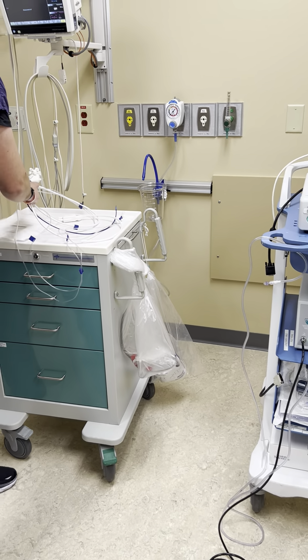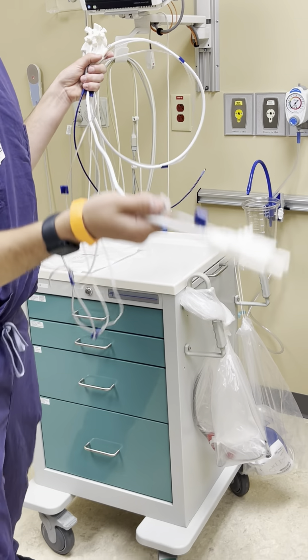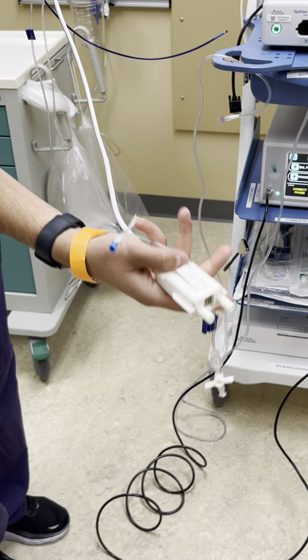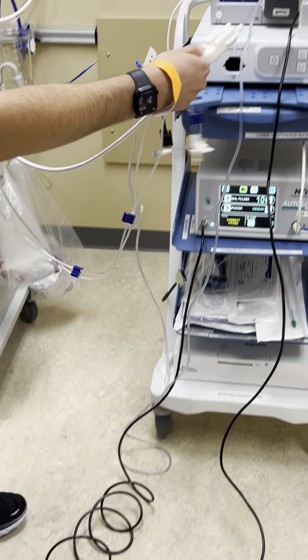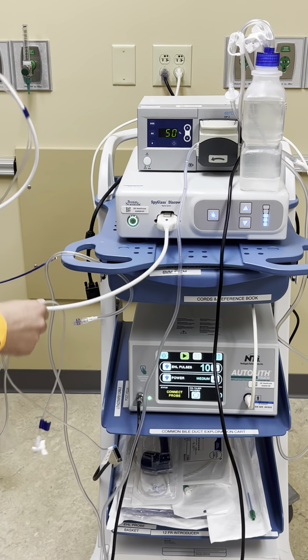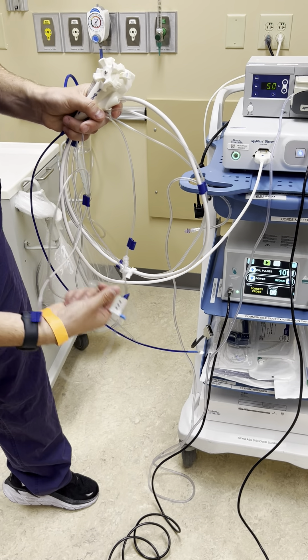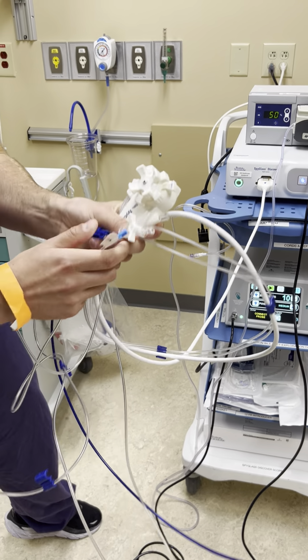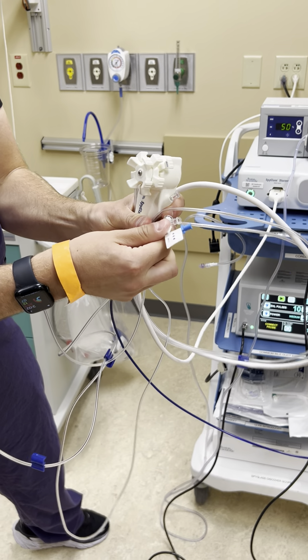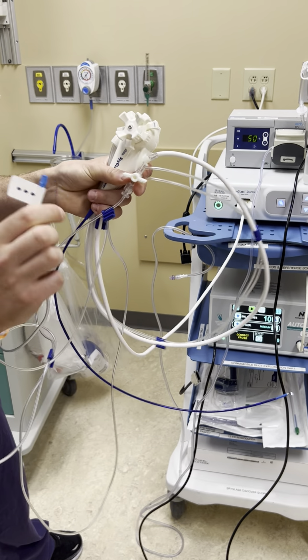Next we can grab our scope. Our scope is going to have three cords. The first — the white one — we're going to plug that into the actual discovery unit here and hear that click in. Next we have our two clear tubings. For the first we have our white one with a stopcock — we're just going to shut that stopcock off and leave that alone.